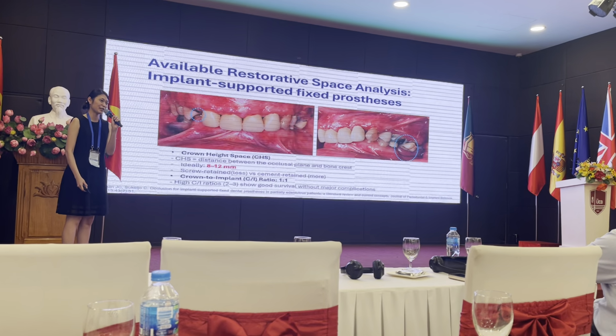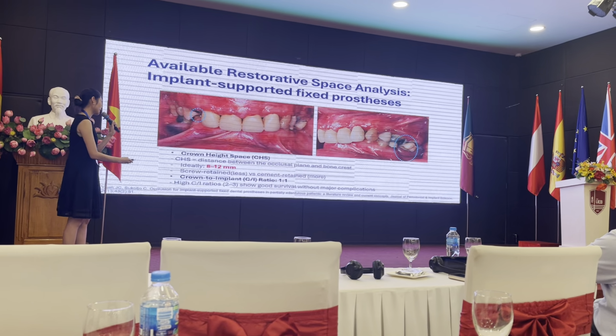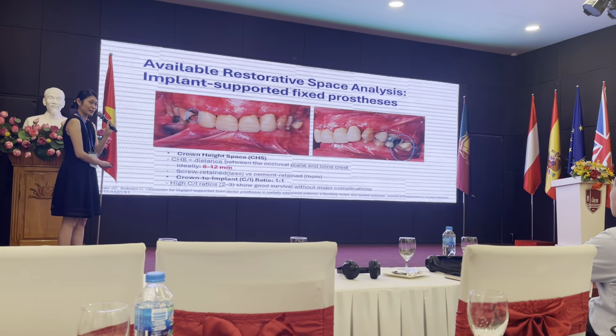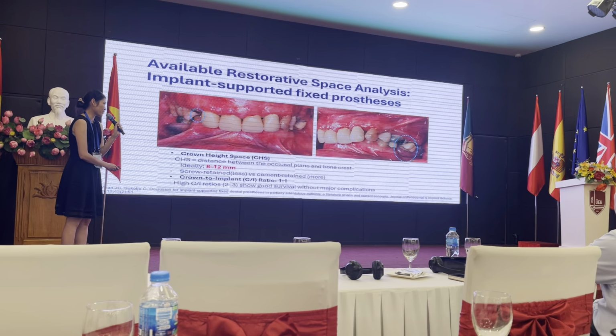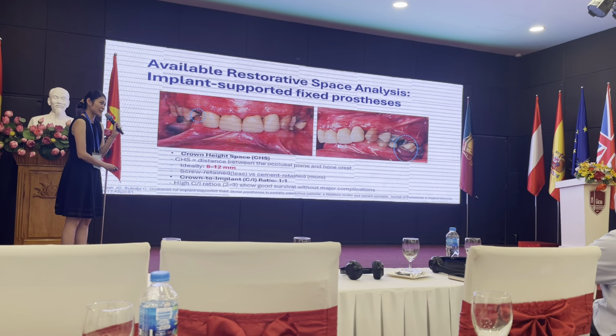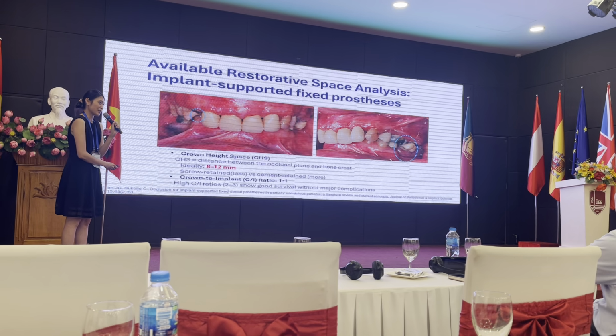So for example here, you can appreciate this is a case where the patient has a 100% deep bite, and the vertical restorative space is very low.